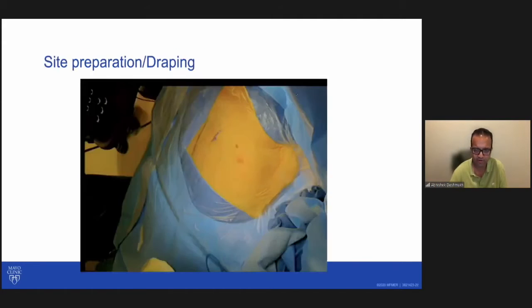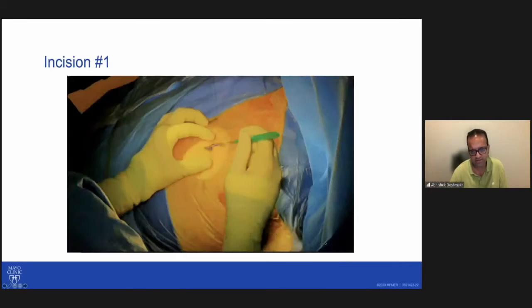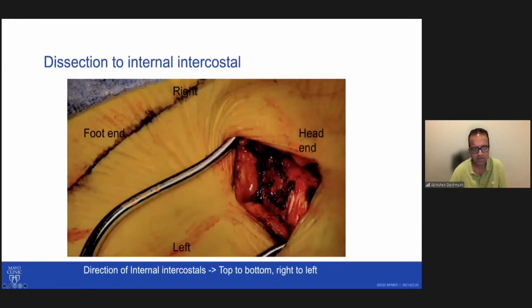So this is from one of our recent cases. It's quite a wide prep for the site. We make an incision here in the parasternal space. After marking it from an ultrasound, the incision should be big enough that we should be able to put an echo probe to identify that we have a good acoustic window and there is not much lung or other soft tissue between this and the electrode, which is subsequently going to get placed.